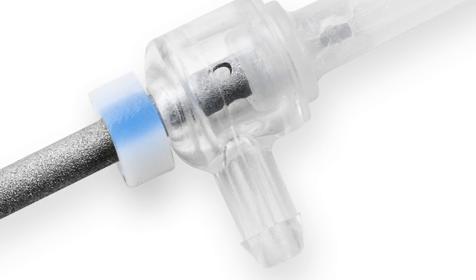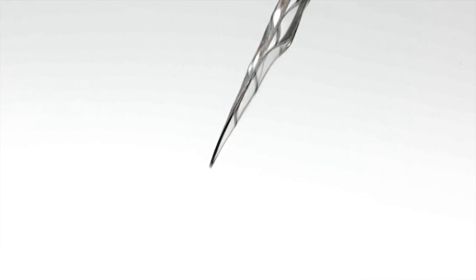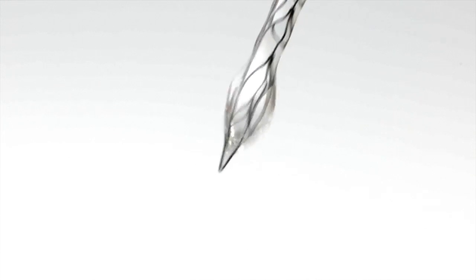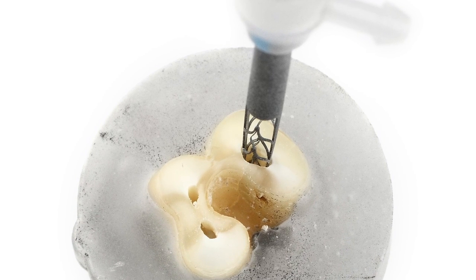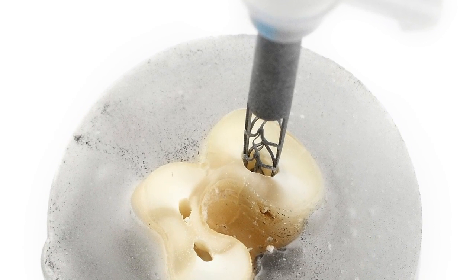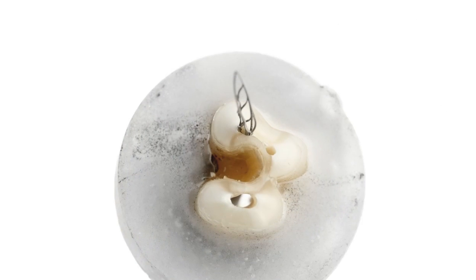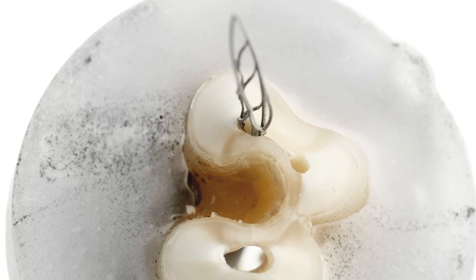An irrigation bar built into the hollow shank enables the dentist to irrigate simultaneously during shaping, facilitating superior cleaning and disinfection. The file does not impose its shape on the canal. Instead, it will custom fit itself to any root canal anatomy and shape it in a minimally invasive way, removing more contaminated dentin while conserving healthy tooth structure.